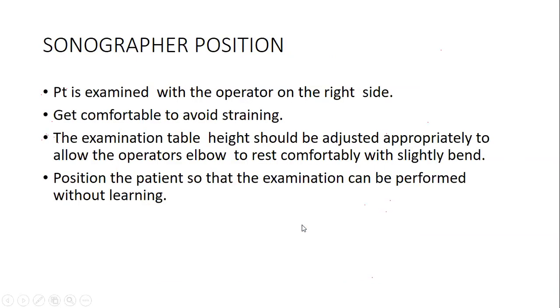Sonographer always must be, not always, but make sure that you examine the patient on the right side of the patient. Then you can also be on the other side, though it's more strenuous for those who are left-handed to start examining the patient on the other side. But typically, the operator can be on either side as long as they are able to pick images that are of good quality and oriented according to the image expected.